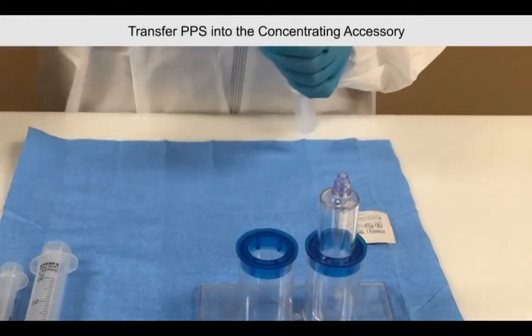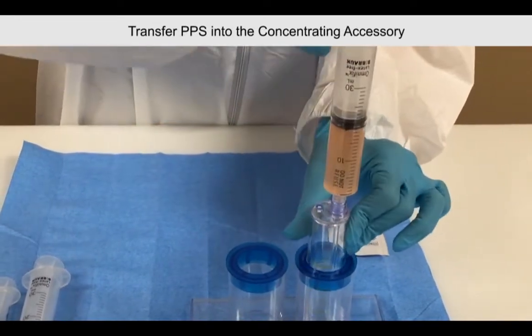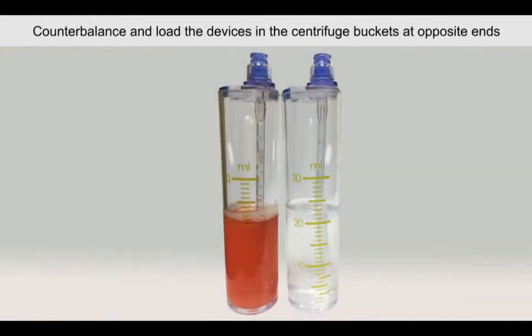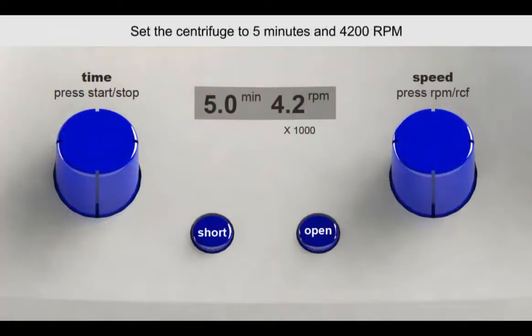Transfer the platelet plasma suspension into the concentrating accessory. Counterbalance with the provided accessory counterbalance device and place back into the centrifuge buckets at opposite ends. Set the centrifuge at 5 minutes and 4200 RPMs. Close the lid and press start.